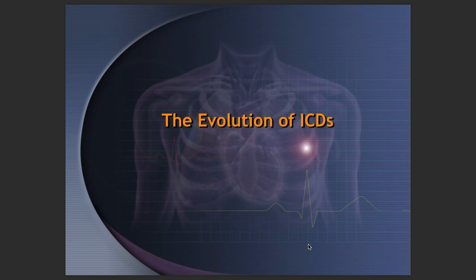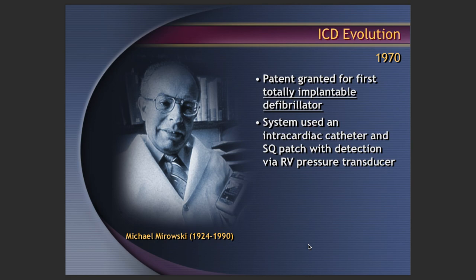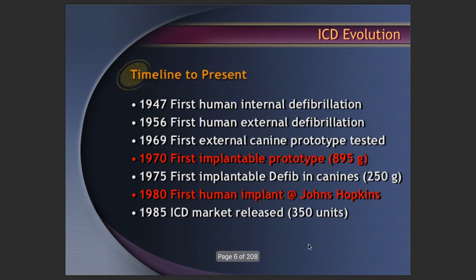One of the common questions that always comes is, how did the ICDs evolve? It was way back in 1970 that the patent was granted for the first ICD, which was implantable, in fact. It was granted to Dr. Mirowski. If we look in the history, there were external defibrillators or internal defibrillators as well. However, they were not implantable.